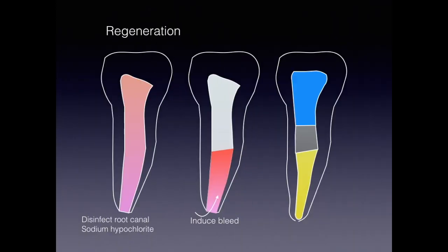So in diagrammatic form, we can see that the root canal is disinfected, the blood clot induced, and then sealed using a bioceramic.